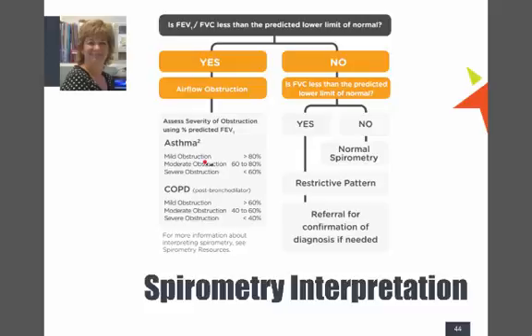That means I need to be treating them. I shouldn't be letting them go home if their airways are less than 50% open of what they should be, especially if they're asthmatic, which means they probably could get worse quite quickly. With COPD, I'm looking at how bad they are. But COPD is chronic. It doesn't change day to day. And I'm looking at how severe is their disease. And again, you said this tells me what sort of treatment I'm going to look at in the future.